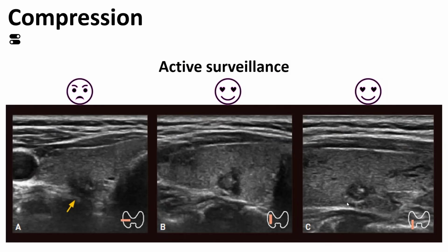This is an important factor in determining active surveillance. So you can think of it as understanding the nature of the nodule through proper pressure rather than pressing as much.